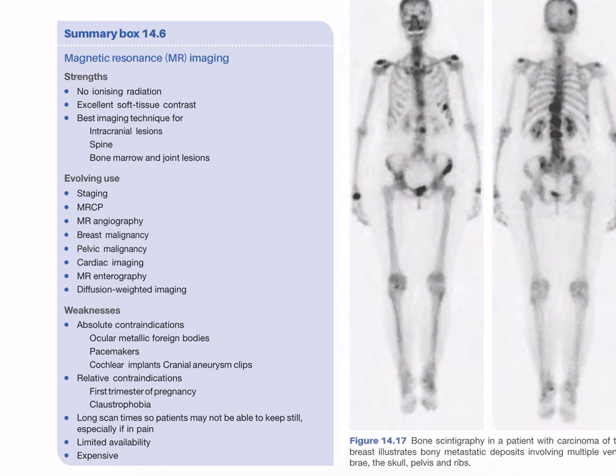Weakness: absolute contraindications, ocular metallic foreign bodies, pacemakers, cochlear implants, cranial aneurysmal clips. Relative contraindications: first trimester of pregnancy and claustrophobia. Long scan times, so patient may not be able to keep still, especially if in pain, limited availability and expensive.